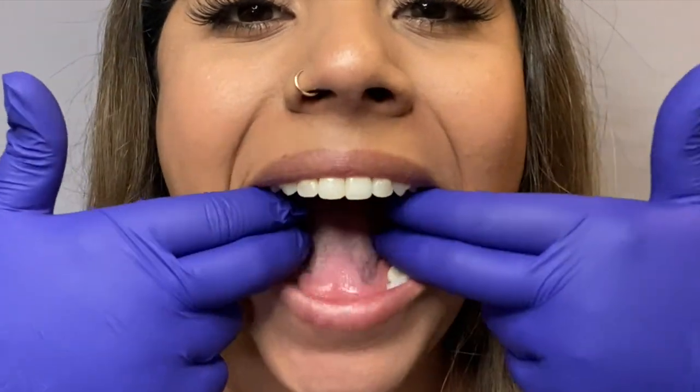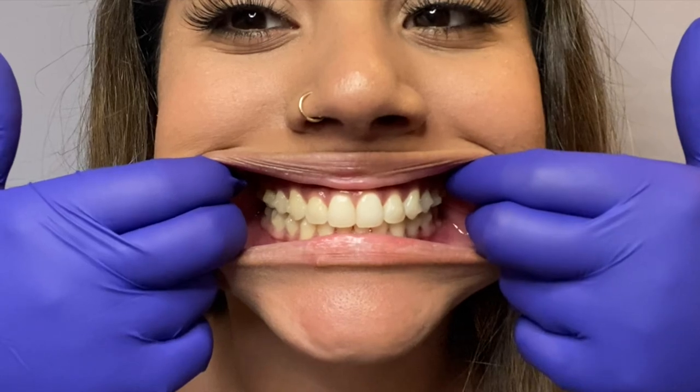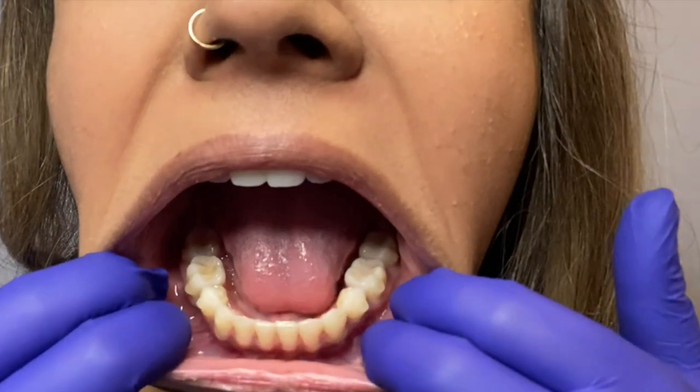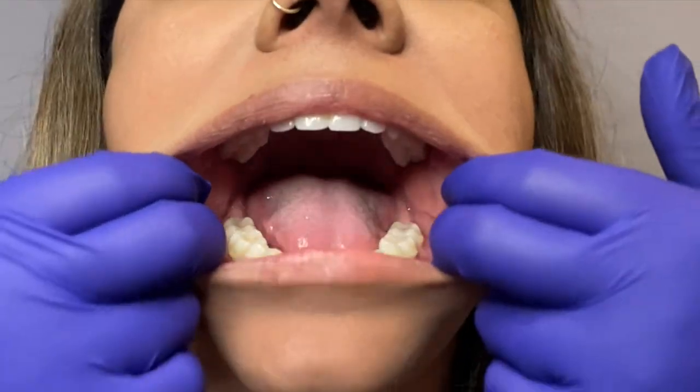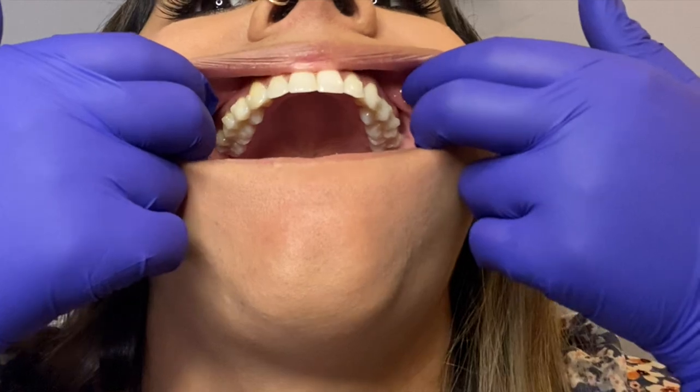Some of your appointments will be done virtually. We will text you when it's time to do a virtual check. The first type of photo you want to take is biting down — make sure you're retracting your cheeks so that we're able to see everything. Then we will take a picture of the lower teeth and then a picture of the upper teeth. You will text those back to us and we will get back to you with some home care instructions.